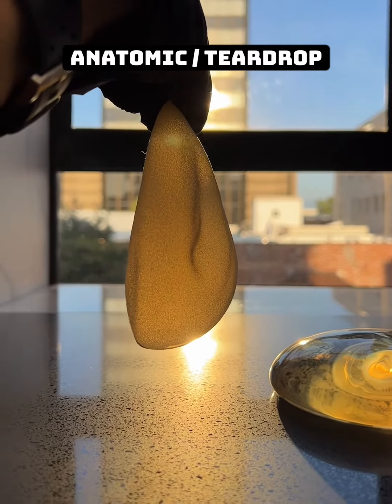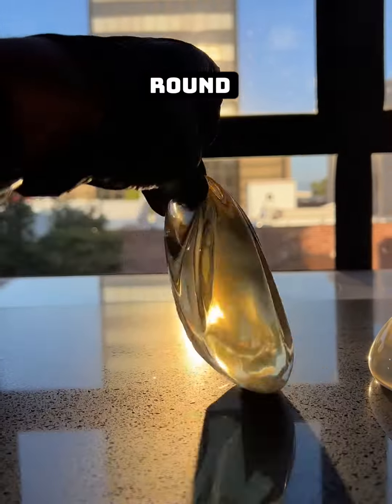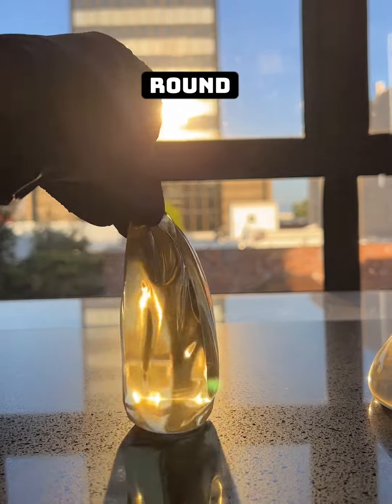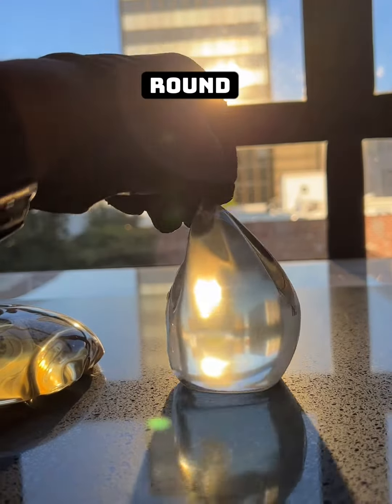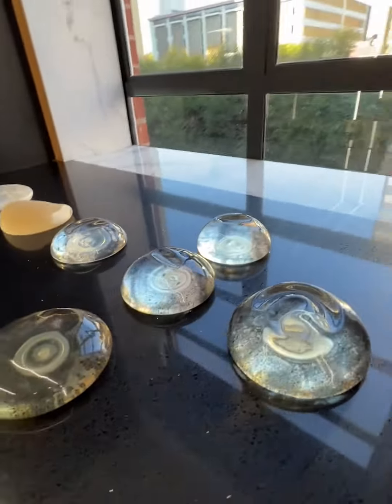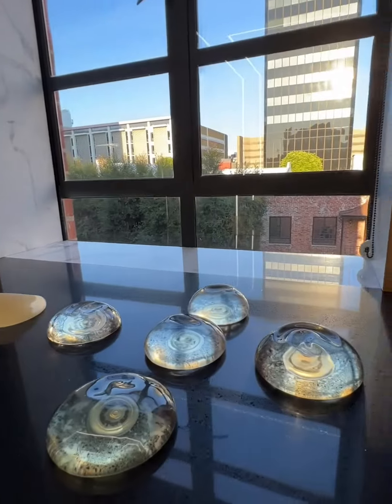This is meant to mimic the natural shape of the breast, where the majority of the volume hangs at the inferior pole. However, when a smooth, round implant is held upright and placed into the breast pocket, especially under the muscle, it too takes on the natural anatomic shape of the breast. And there you have it, all the variables that a plastic surgeon and the patient must take into consideration when custom tailoring their approach to breast augmentation.